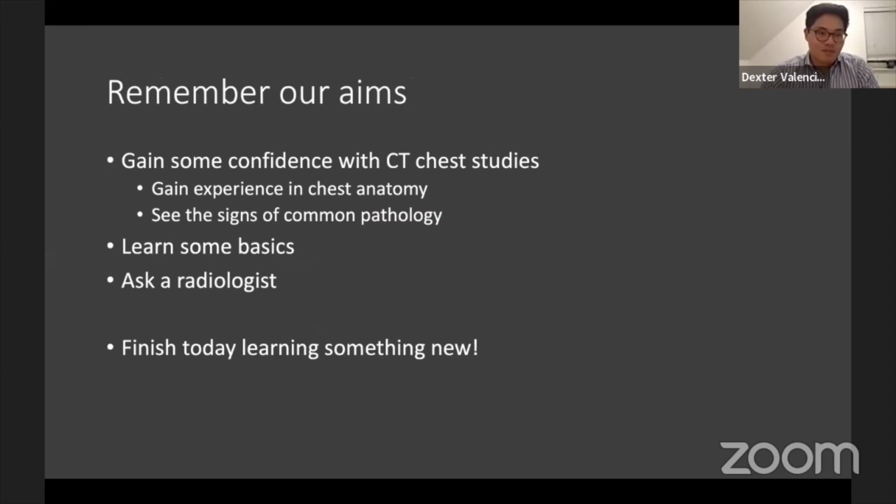So just closing up, the whole idea of today was to gain some confidence looking at some CT chest studies, see normal chest anatomy, see some common pathology, and maybe some uncommon ones, which I've mentioned. I wanted you to learn some basics, so hopefully you've learned some basics from chest x-rays now translated to CT chest. You've asked a few questions for me, and I'm happy for you to ask some more. So hopefully you've finished today learning something new.